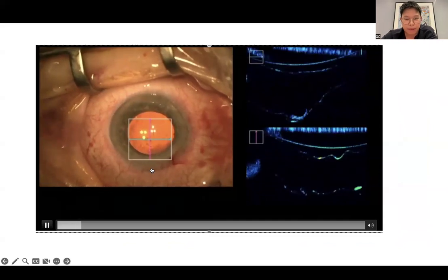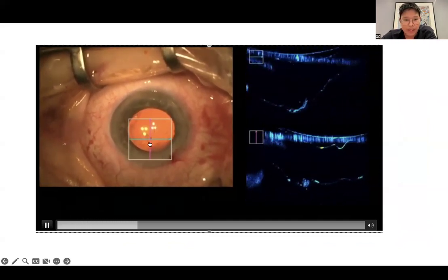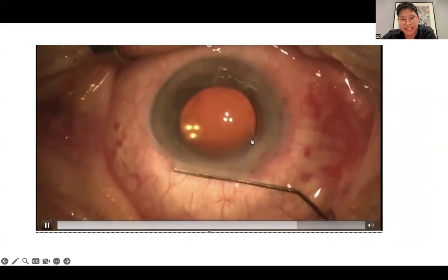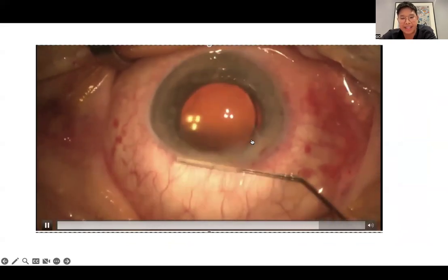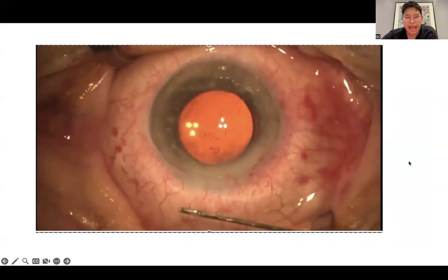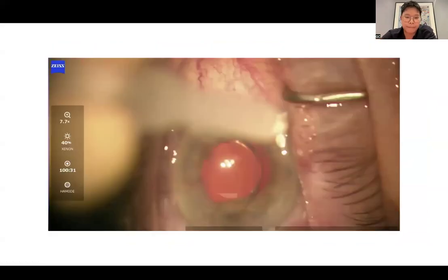And here's that intraoperative OCT. Here we're zooming down, and you can see there's a whole bunch of debris and dirt. You think that it's in the vitreous, but in actual fact, the IOCT shows that it's remnants from the cataract surgery and from the lens that's sitting behind the capsular bag there. So once again, in intraoperative aqueous misdirection, what you're doing is hydrating this potential space.